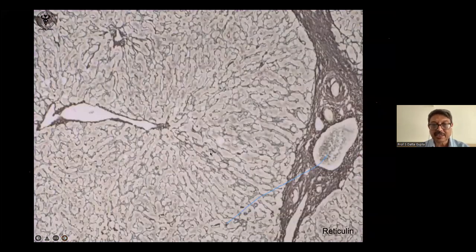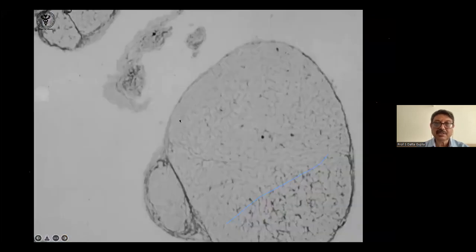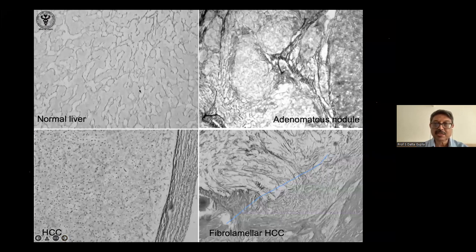This is a reticulin stain. With reticulin, we see the normal maze-like pattern of hepatocytes. When it becomes parallel, then we worry. It shows that the hepatocytes are becoming parallel, that we see in drawings, and it means there is an alteration in the architecture. You see this, and you can make out cirrhosis better because you can see this fibrous tissue around nodules with the reticulin staining. This is the normal liver. When the reticulin disappears, then you worry.